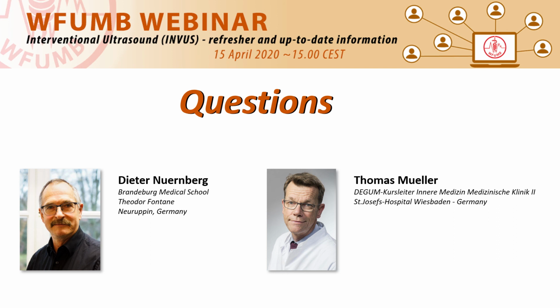Make a difference between simple interventions, like, for example, venipunctures, or complicated interventions, locally ablative therapies, drainage placement, IV line placement, like in surgery. In fact, 2 years ago, we published very sophisticated recommendations for hygiene on interventional ultrasound, recommendations on infection control on interventional ultrasound. Google that, you will find the recommendations of the German Ultrasound Society. Download it for free, it's written in English.